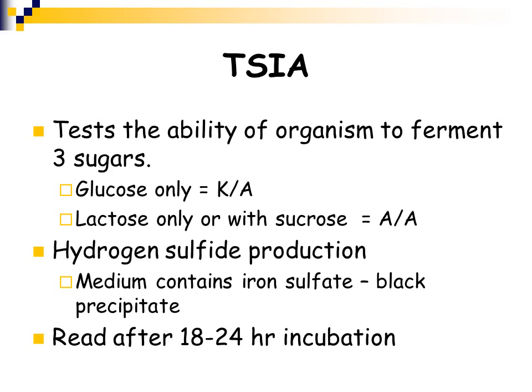TSIA, or triple sugar iron agar. This is one of the most important tests that is manually performed in a clinical laboratory. You're not going to perform this test very often. You might do it if there's a discrepancy or if the instruments were down, but in the past we did perform this test very often, and it is a very good way to differentiate all your different gram-negative bacilli.